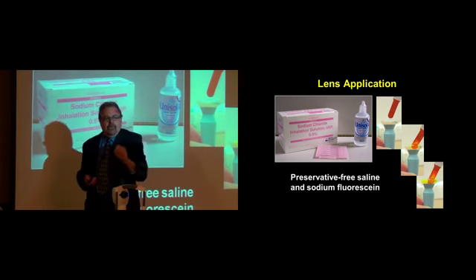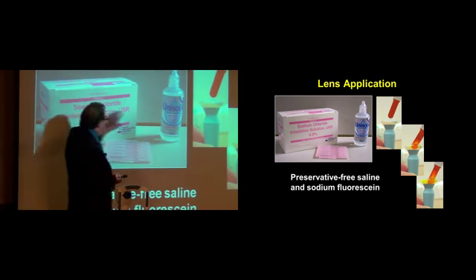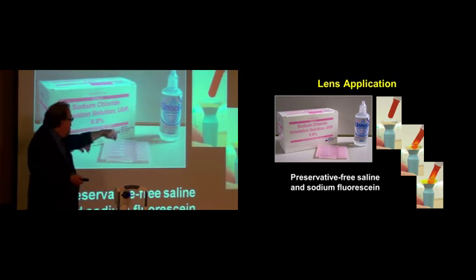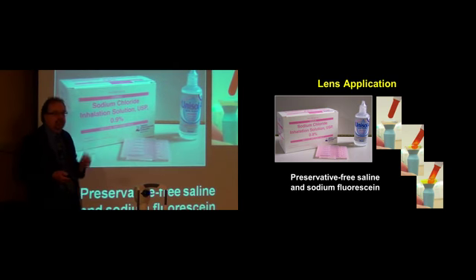I'll be saying a few words about this solution a little bit later on, but we use two preservative-free salines. One is Unisol. The other is a hospital-grade saline solution, which is called inhalation solution.